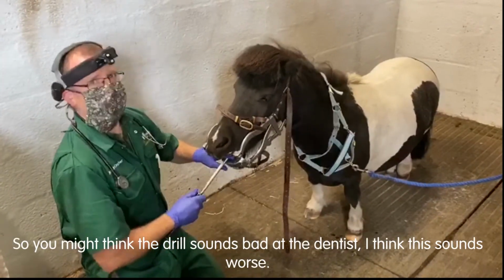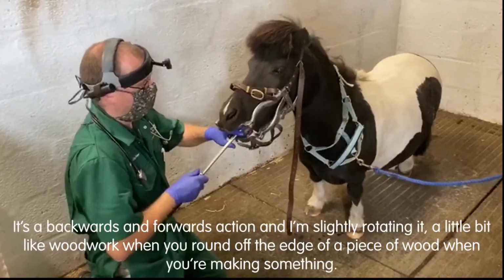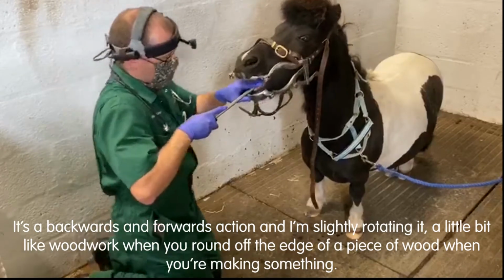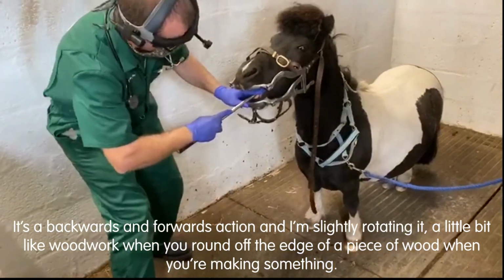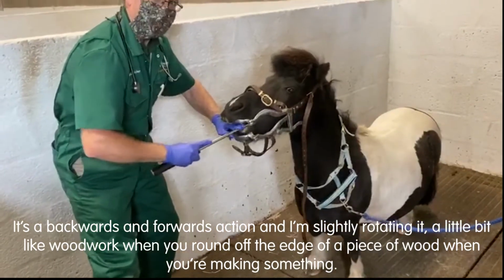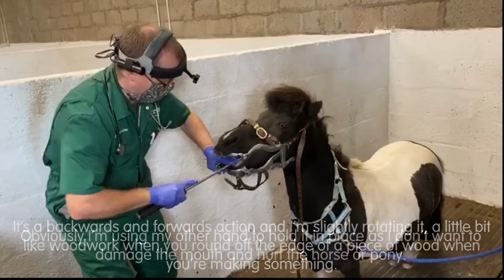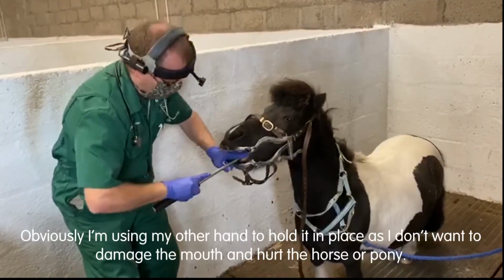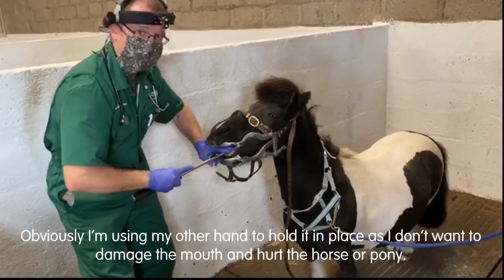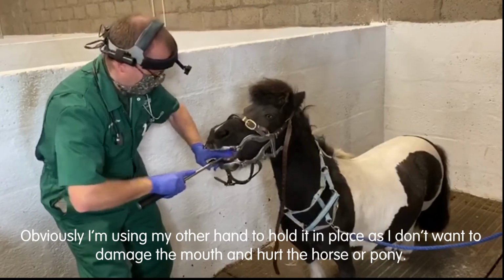So you might think the drill sounds bad at the dentist. I think this sounds worse. So it's a backwards and forwards action, and I'm slightly rotating it, a little bit like woodwork, where you round off the edge of the piece of wood when you're making something. Obviously I'm using my other hand to hold it in place because I don't want to damage the mouth and hurt the horse or the pony.